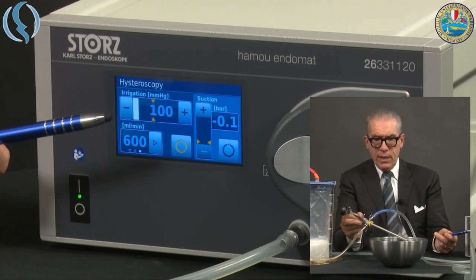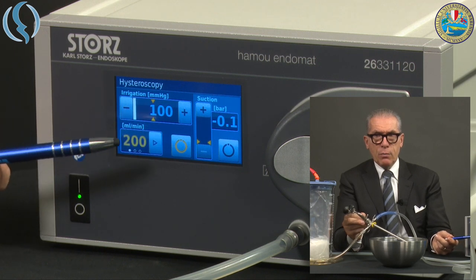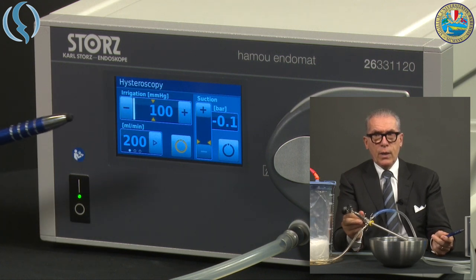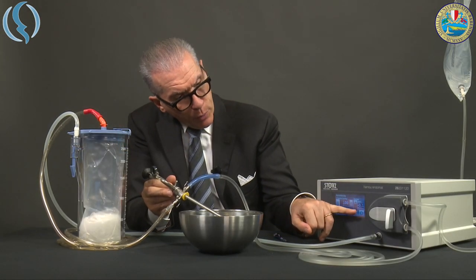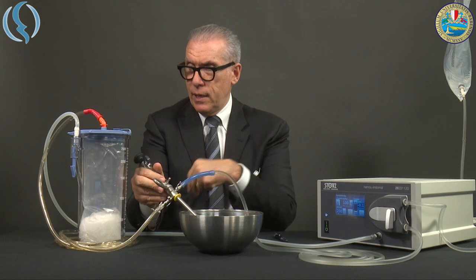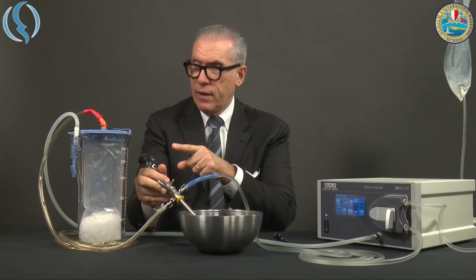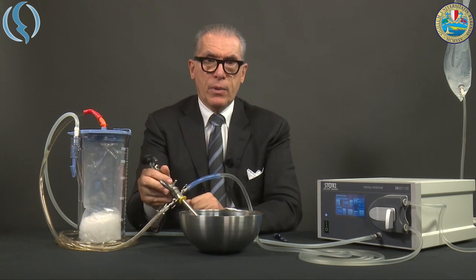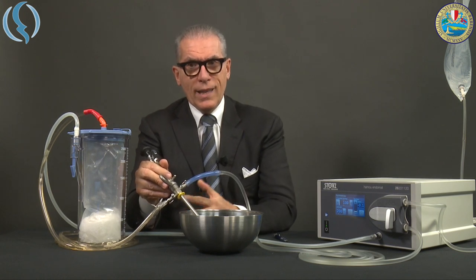At 600 ml per minute the turbulence is even higher, meaning we are creating turbulence inside the channel. It is therefore much better to remain around 200 to 400 ml per minute, and it will work perfectly. Activating the aspiration, the pump aspirates the air — inside the receptor a vacuum is created, which then aspirates liquid from the aspiration line and the liquid starts going into the receptor. This is exactly the same as what happens with the old Endomat.